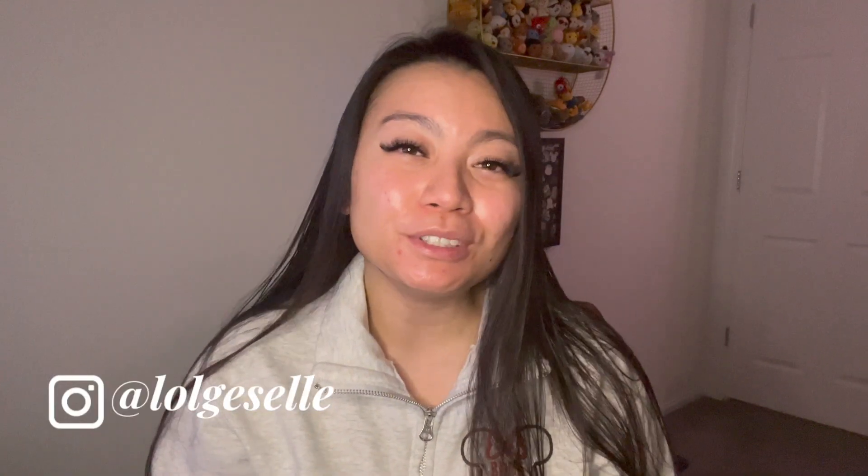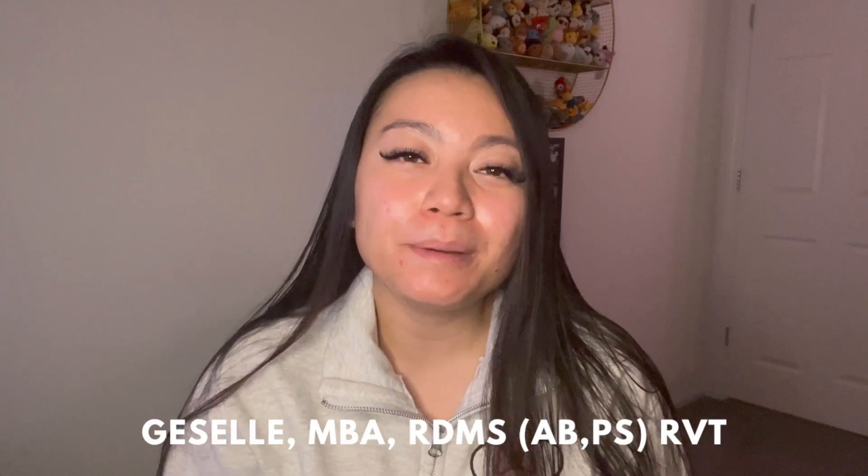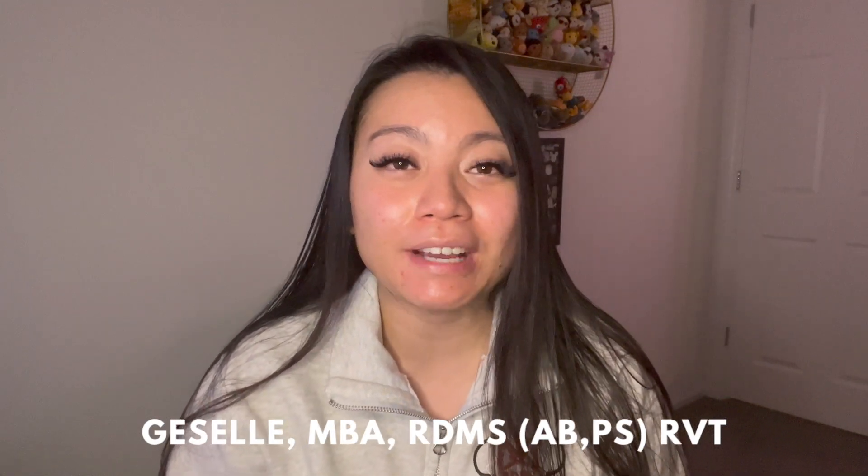Hey guys, it's Giselle here. I'm an ultrasound technologist, aka sonographer, out here in Las Vegas, and today I'm going to teach you guys how to do a vascular ultrasound on the legs to check for blood clots.